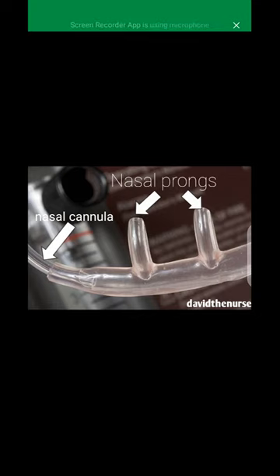But when you see a patient who is hemodynamically stable, the vital signs are essentially within normal range, but just having slight, mild respiratory distress, respiratory rate about 30, 32, oxygen saturation of maybe 94%, 93%. So you just want to give a little amount of oxygen, as low as 1 liter per minute, as low as 2 liters per minute. The right device to use is the nasal prongs. I believe you get that. So if you want to give low delivery oxygen, let your mind first go to the nasal prongs.